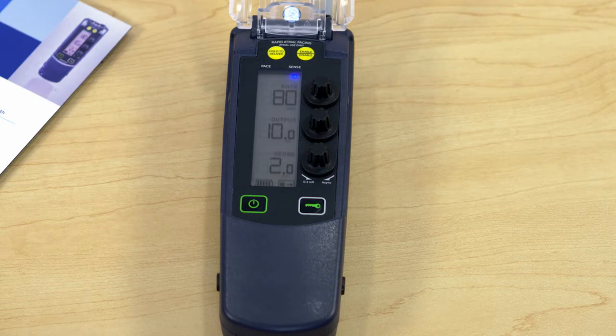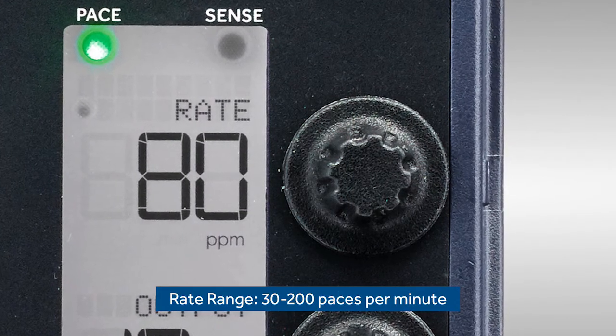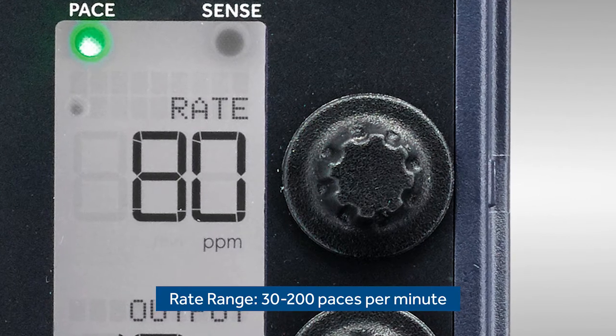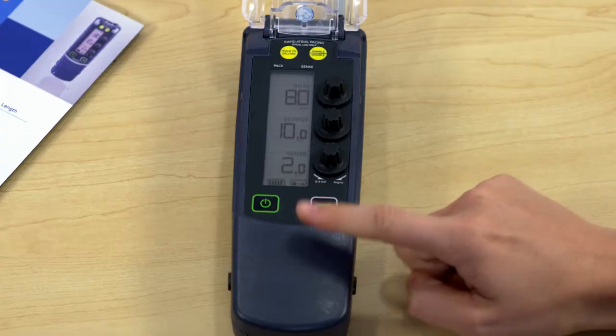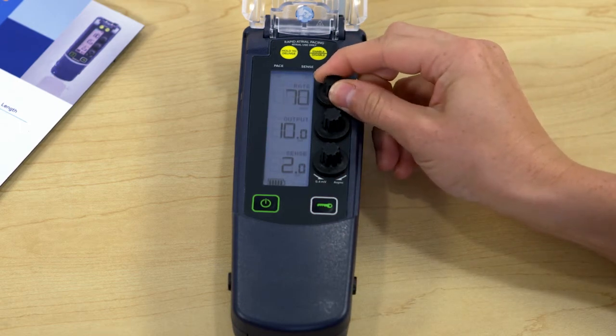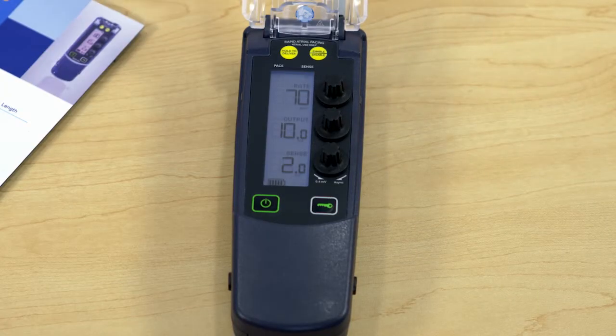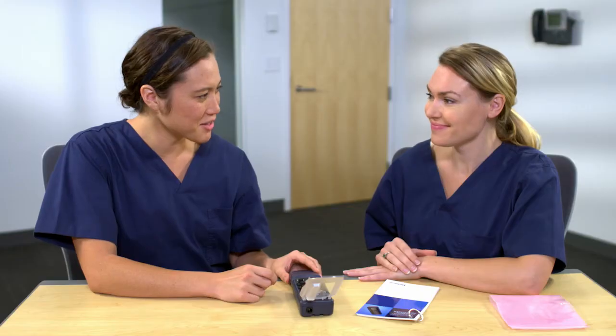Next, we'll discuss the knobs used for programming the settings. The top knob controls the rate. The rate range nominal is 80 paces per minute and goes from 30 to 200 paces per minute for all patient types and needs. We need those higher rates for our pediatric patients. Go ahead and change the rate to 70 paces per minute. First I'll need to unlock the device. I can hear and feel the clicks as I turn the knob — turning clockwise for higher numbers and counterclockwise for lower numbers.